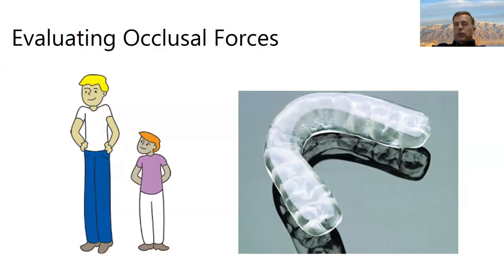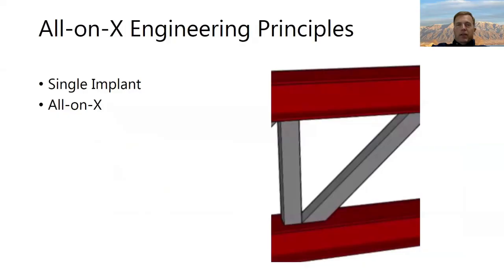What is it opposing? Is it opposing a denture? Is it opposing a full arch of crown and bridge, or something in between? Don't forget about bite splints. Bite splints can be an awesome way of protecting those restorations. And sometimes, especially with removable restorations, you'll even make an overnight restoration where you remove the daytime restoration and put in a nighttime restoration that specifically serves as a night guard. So anyhow, a major consideration we want to make sure we take into account.